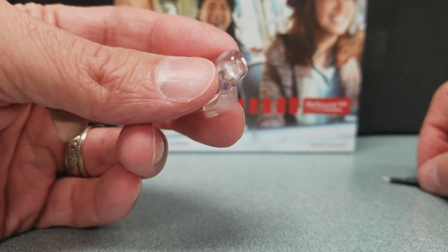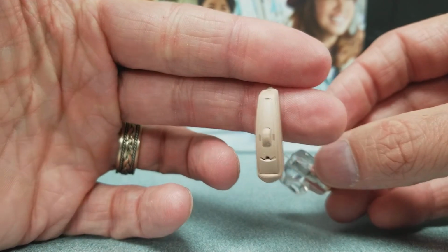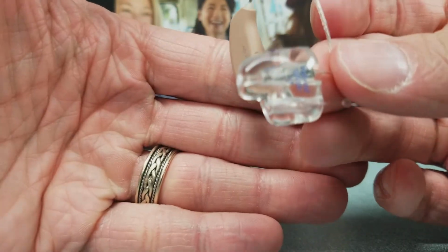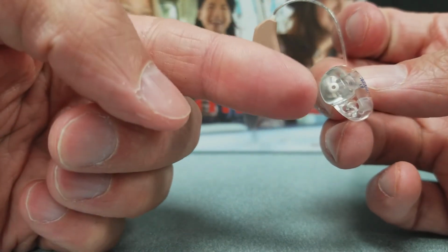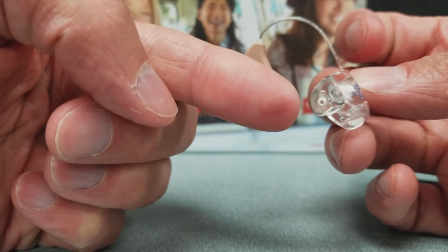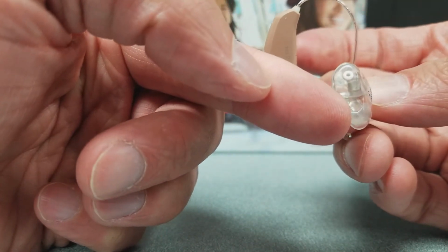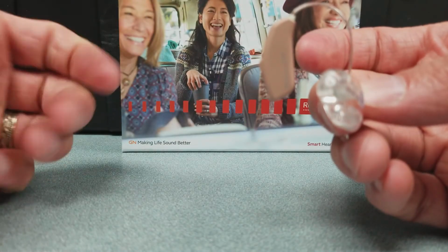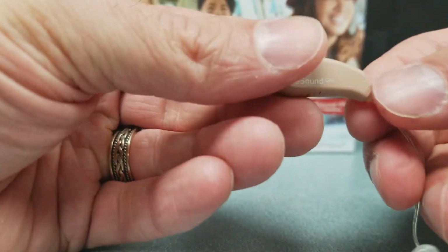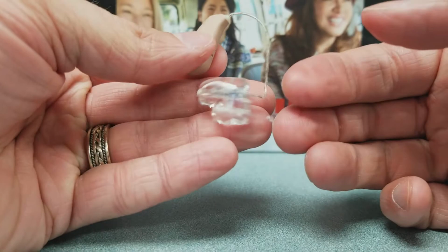So, to recap, maintenance cleaning. You're going to brush your microphones after you wipe it down. You're going to wipe down your custom ear mold, and then you're going to replace your wax guard every month, maybe a little bit earlier, like say every 2 to 3 weeks, and then you have to clean that air vent that's right there. I hope this video was helpful. Like I said, this is for a Resound GN Rick hearing aid.